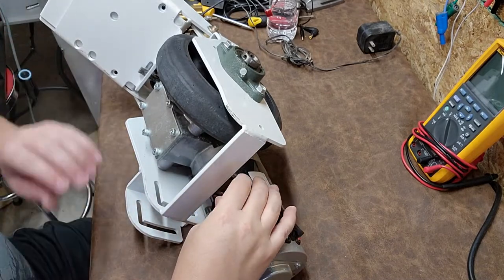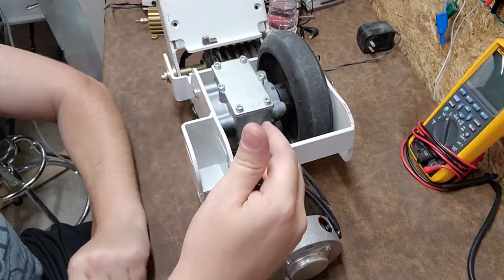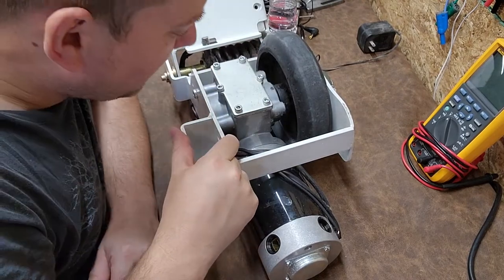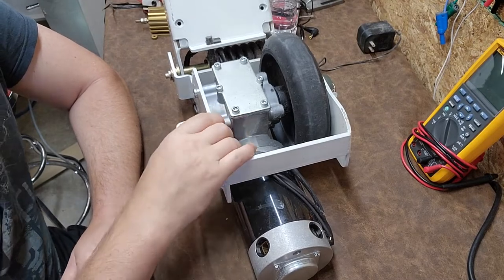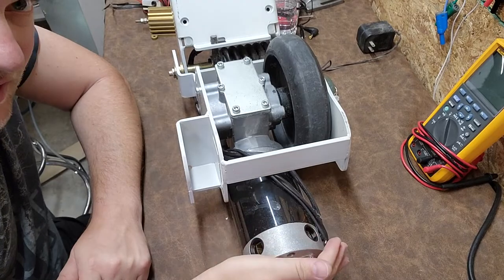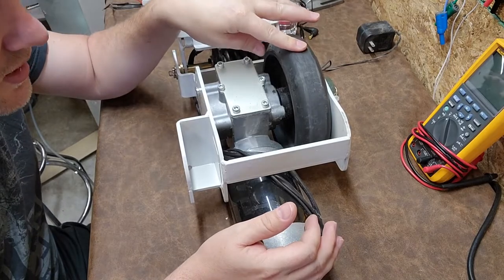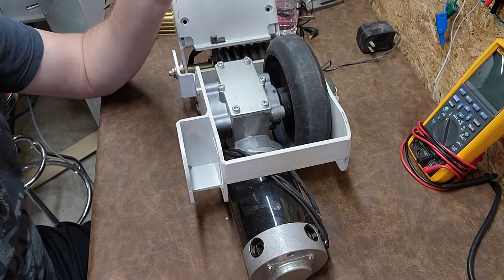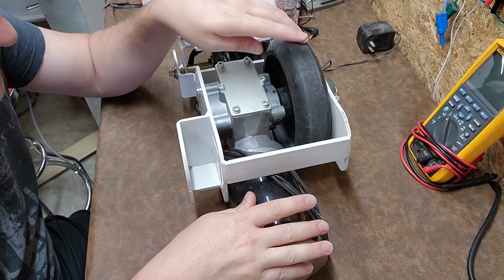Brush motors are used when you need a lot of torque and an efficient motor. This four-pole motor goes into a gear reduction drive, and inside there's probably going to be oil with the gears submerged in it. This motor might spin at five or six thousand RPMs, but the output right here might only be three or four hundred RPMs - so it could be a 10 or 20 to 1 ratio.